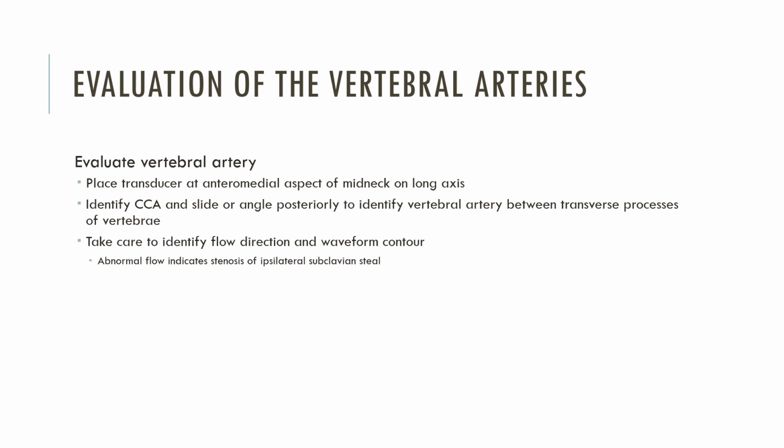And we're going to measure our spectral. We're going to look for that normal blood separation in the bulb, and then we're going to identify which vessels are ECA and ICA. Our ECA should be anterior, respond to temporal taps, and have a higher resistance flow. Our ICA is going to be larger, posterior, with lower resistance flow. Our ECA we only need to image in B mode at the proximal region, with color and with spectral at the proximal region.